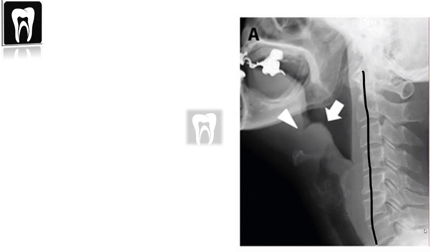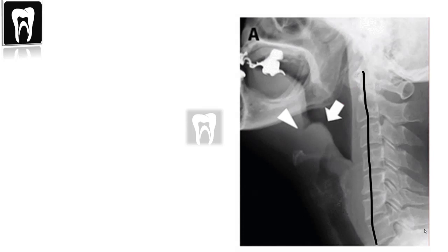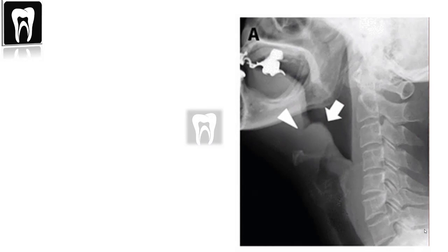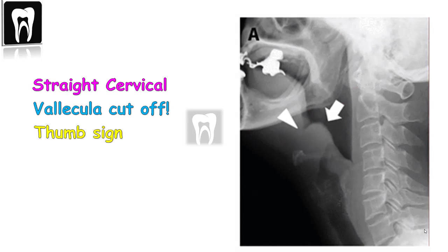In this X-ray, the C-shaped cervical lordosis curve is lost — the spine is straight. The airway is no longer continuing down into the pharynx; this is called the vallecula cutoff sign. The epiglottis appears like a thumb, which is called the thumb sign. All these findings indicate epiglottitis, which is an airway emergency.